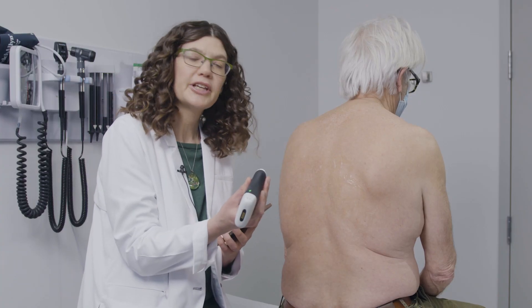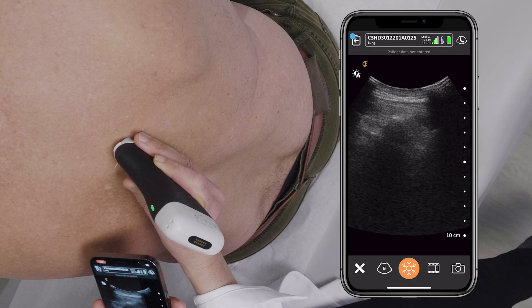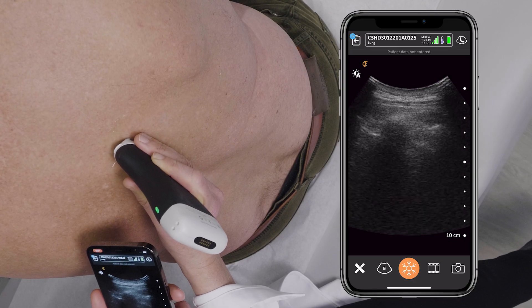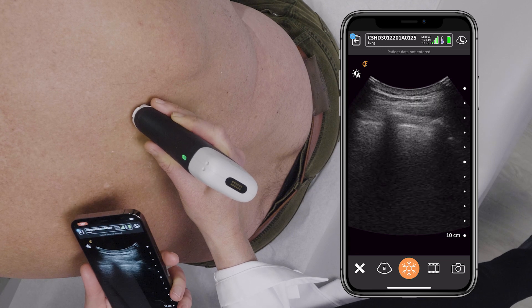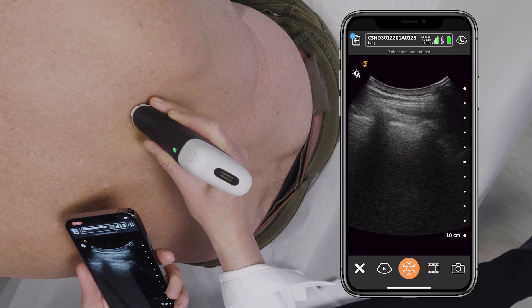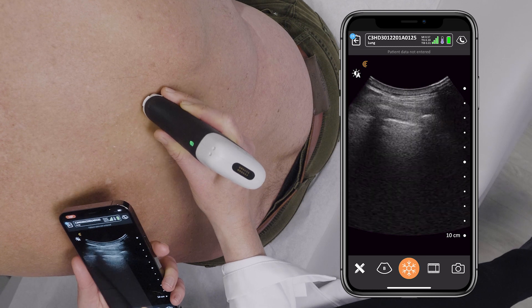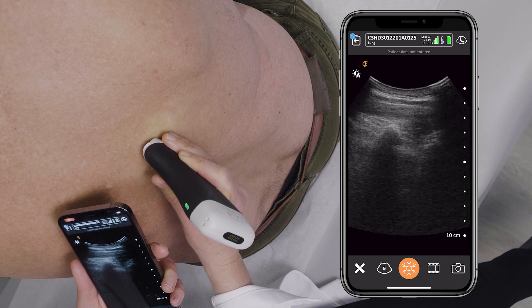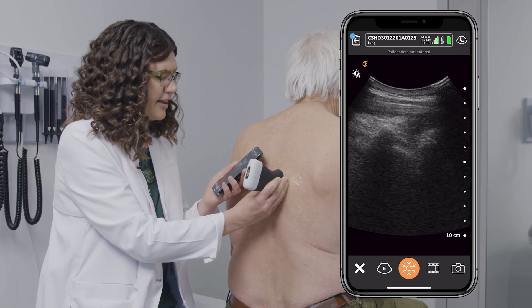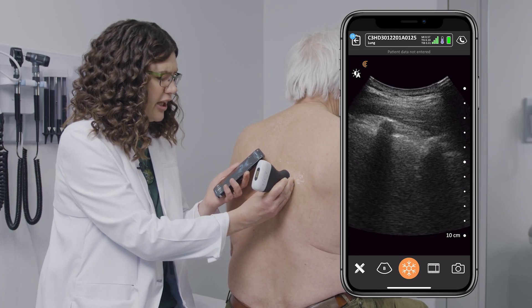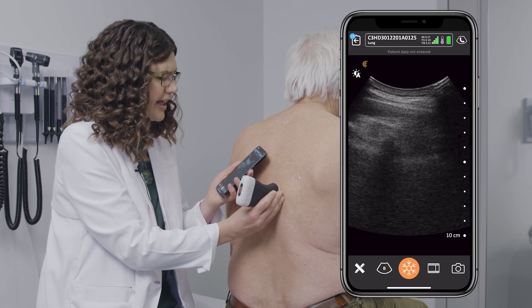I'm going to use my curvilinear probe, with the marker pointed towards the patient's head in longitudinal or sagittal section. I'm going to proceed to interrogate the lung looking for A-lines, which are reverberation artifact that extend down from the pleural line, or for B-lines, which are lines that extend from the pleural line all the way down to the bottom of the screen and kind of look like headlights.